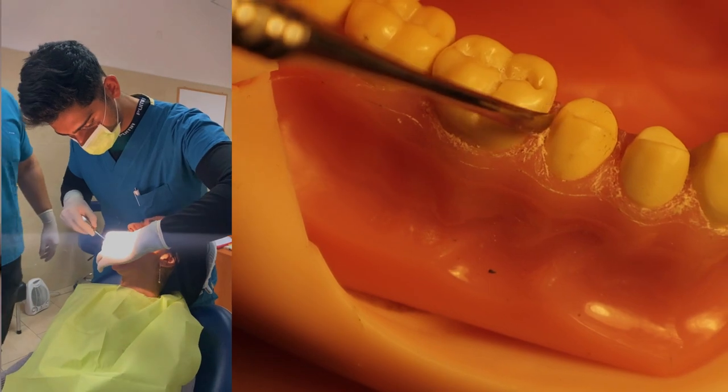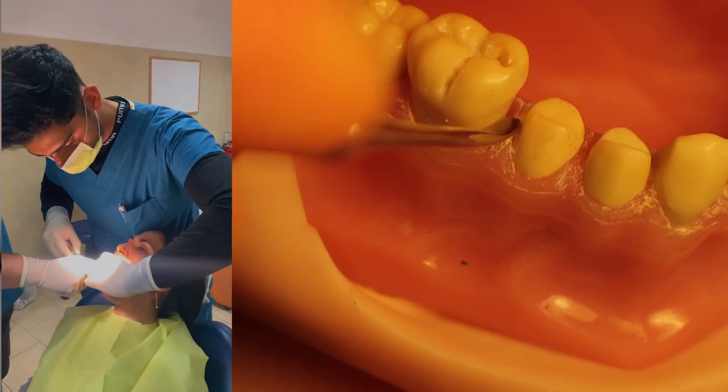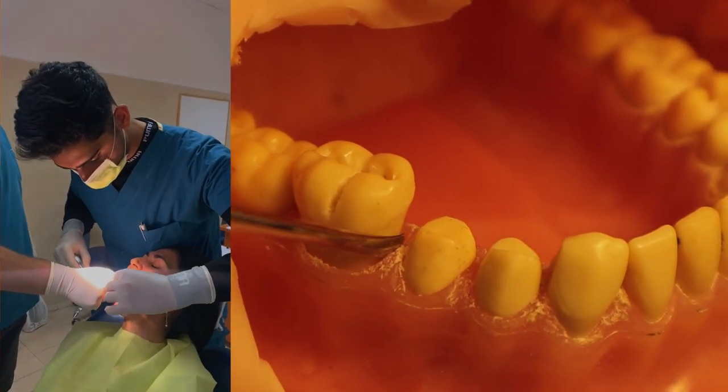Now it's time for luxation — the loosening and removing of the tooth. I started with a straight hand elevator, inserting it into the mesial aspect of the tooth as far apically as it would go, with the working end on the tooth and the other side facing bone, not the adjacent tooth. The motion is rotatory, slowly scooping up the tooth. Because the roots curve distally, inserting into the mesial aspect and rotating follows that contour, allowing the tooth to come out without fractures. I did my rotatory movements and could feel the tooth getting looser and looser.